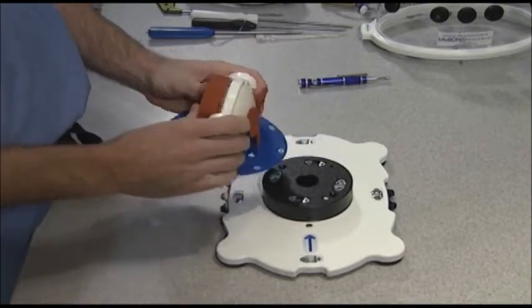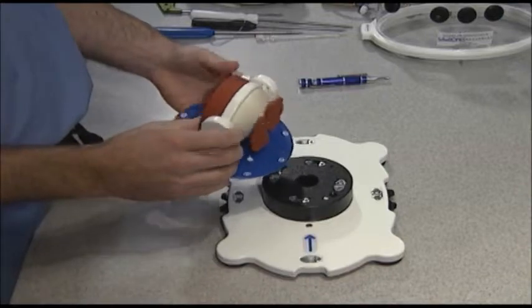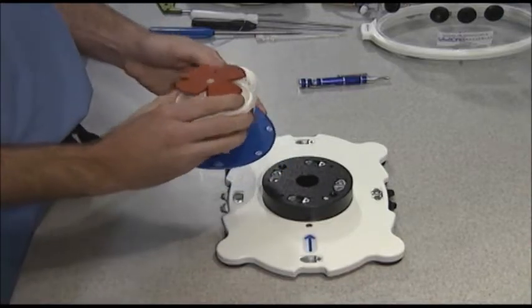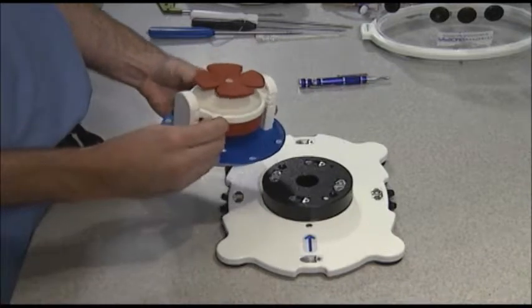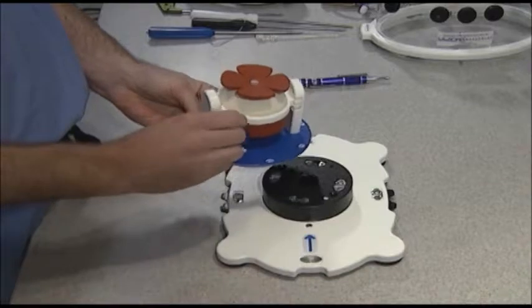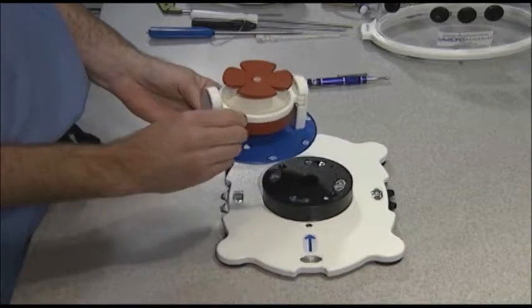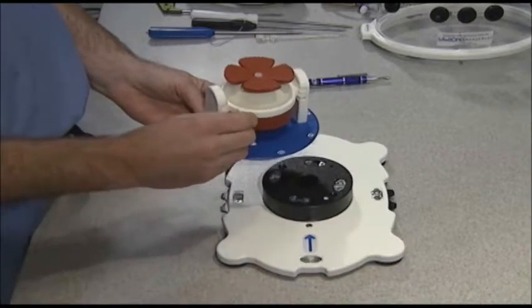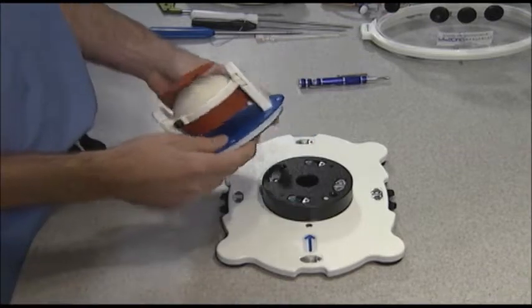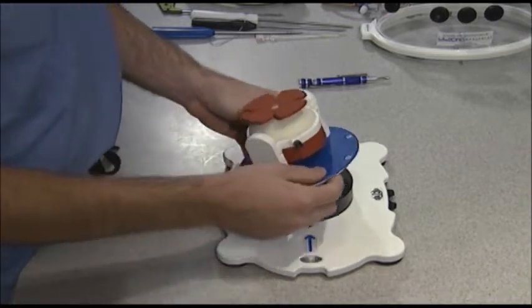It's best to do this with it flipped 180 degrees and then rotate the module to the position that you would like it in. And then you need to make sure that this is secure and twisted into the insert. If it's not, if you're using a mallet or any type of punch, you could drive that down in and you would need to restart the task.